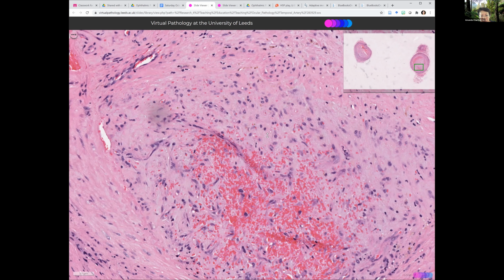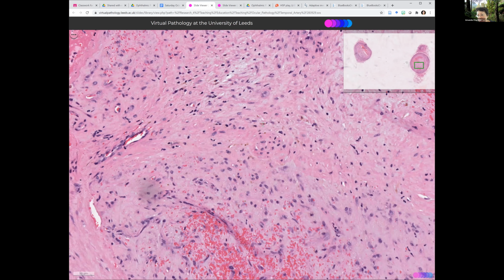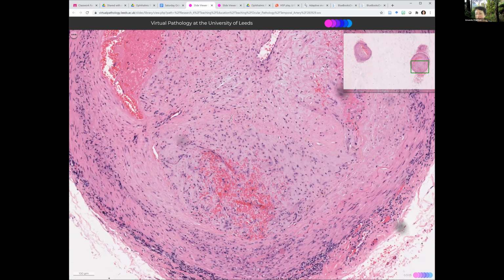And look, we can see this is old. Look at this brown stuff. What's the brown stuff? Is it melanin, team? Hemosiderin? Hemosiderin. Exactly. How long does it take for hemosiderin to accumulate? 7 to 10 days. Well, it does in the heart anyway. So this has been going on for at least 7 to 10 days and maybe longer, several weeks.